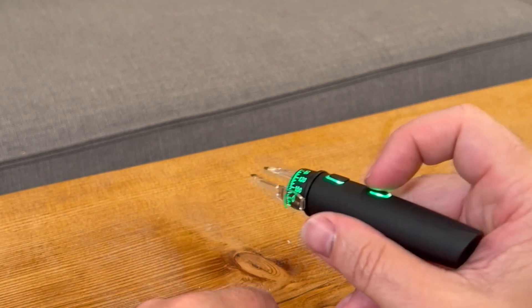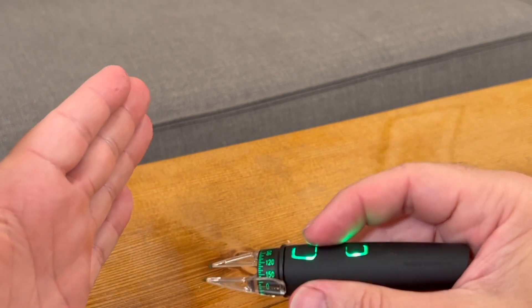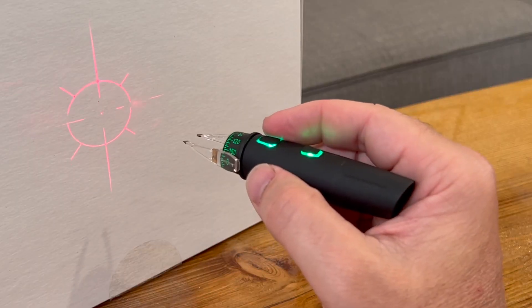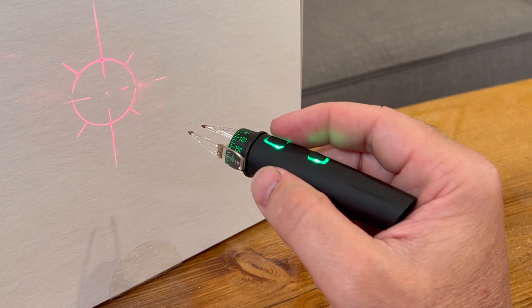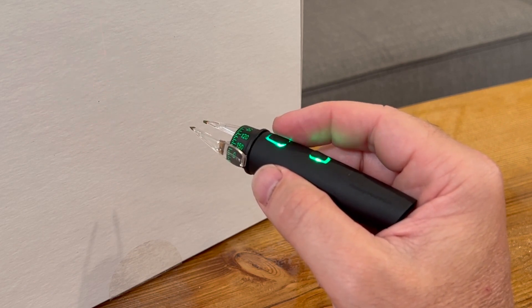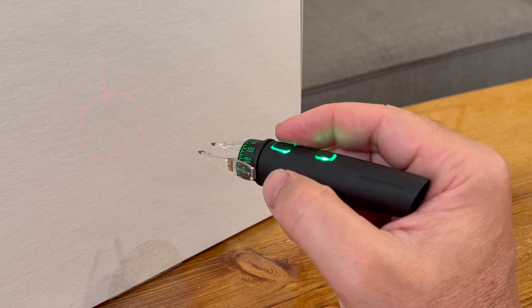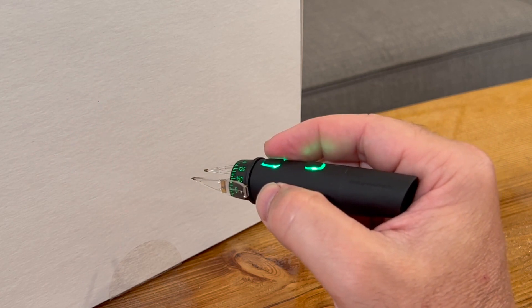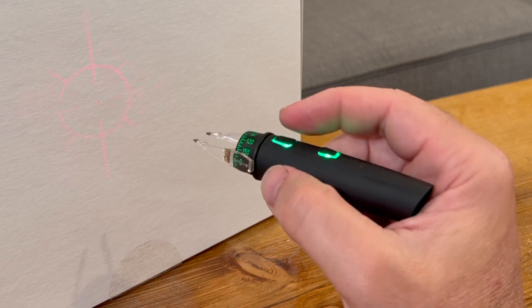Another really cool feature is if you hit the Mode button again, it turns on a laser reticle. You can see it here — I'm shining it on my hand. I'll get a piece of white cardboard to show you. There you can see the reticle, which shines on the patient's eye to make sure you are squared up. If the Robomarker is tilted, the reticle will begin to blink. If you rotate way far out, the reticle will actually disappear entirely. So keep that thing straight.